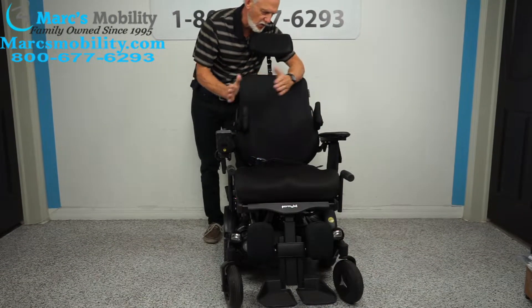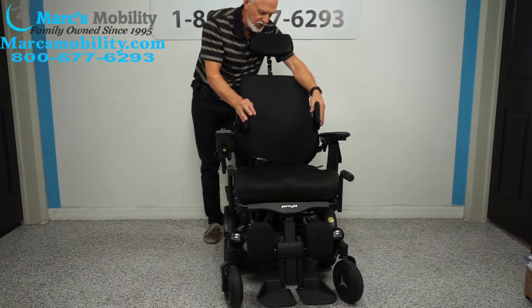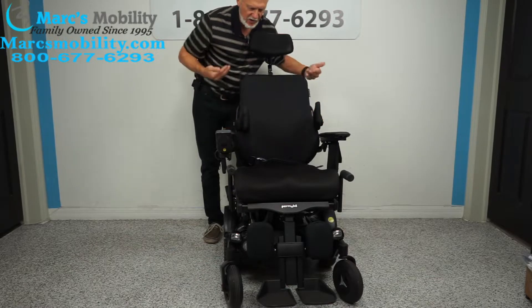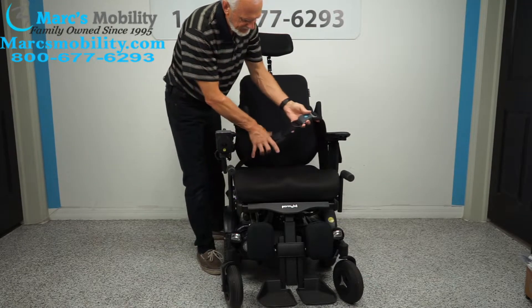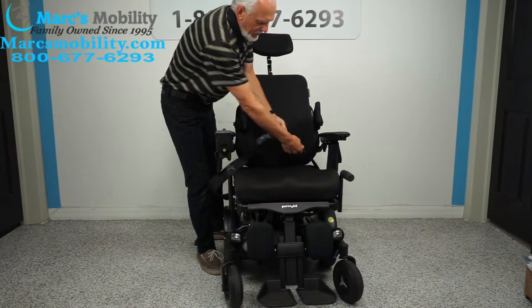You have lateral pads here — if you have a tendency to slide to one side, these keep you in the middle. Some people use one, some use two; if you don't need them you can slide them right off. You also have a deluxe safety belt — notice how wide it is, it's not narrow, it has a pad on it.